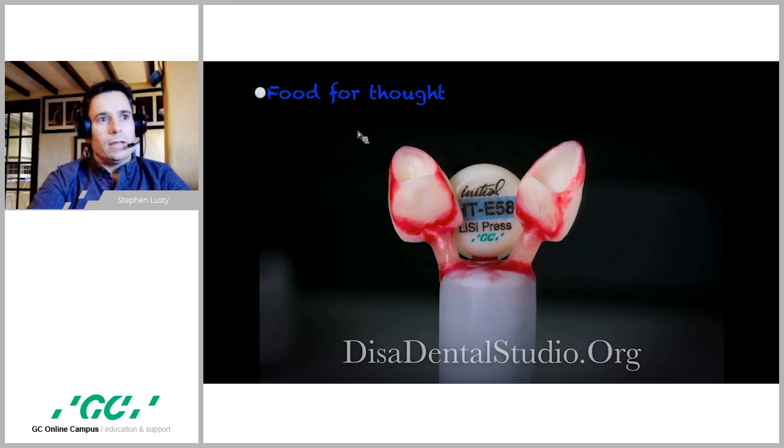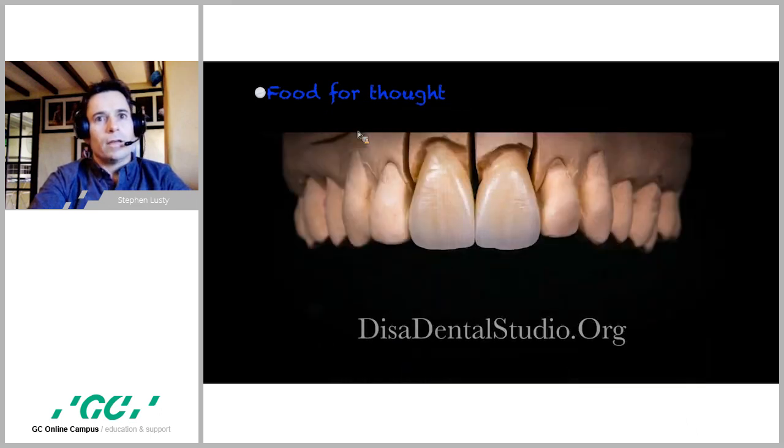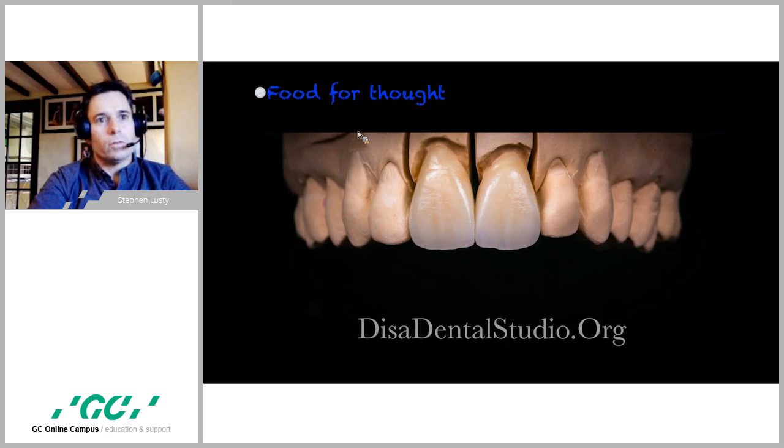Where I see this technique has value is to replace multi-layered zirconia, which in my opinion is not at all aesthetic, and actually the strength is not particularly impressive either. With multi-layered zirconia materials, we have horizontal banding of opacities and strength, which does not emulate nature at all. However, with this technique, the core strength of the zirconia will be 1,200 megapascals and an outer layer of over 500 megapascals, and the positioning of the opacities truly emulates nature. Also, the position of the strength is far more realistic as to where we need it.